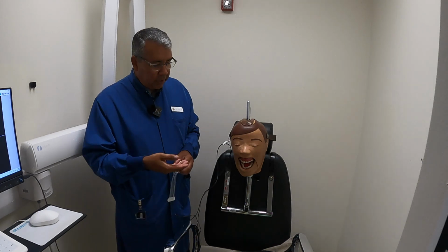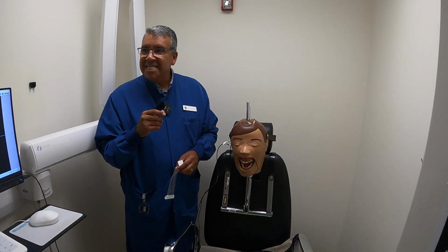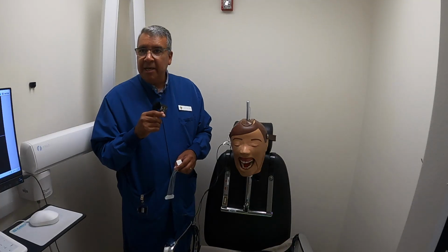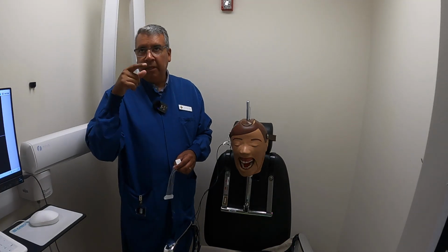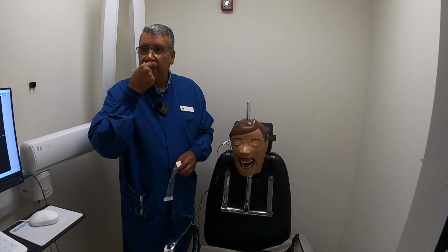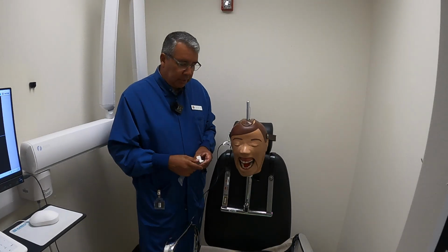Okay, so we're going to reference the lower, and the only time that changes is when the lower jaw is like this, class 3. It's a class 3 bite. Then we reference, no, I'm sorry, the other way around. If the upper jaw is more forward, then we're going to reference the upper one instead.